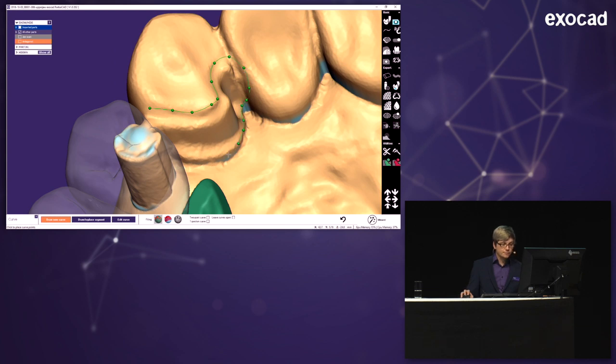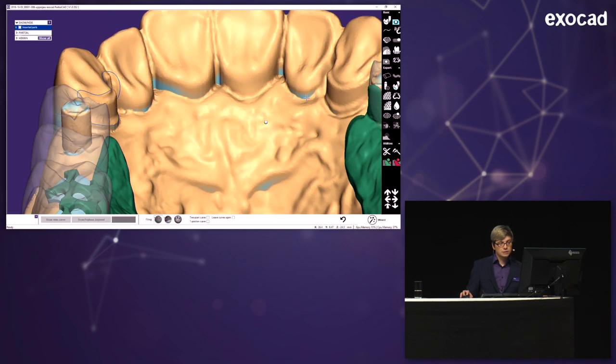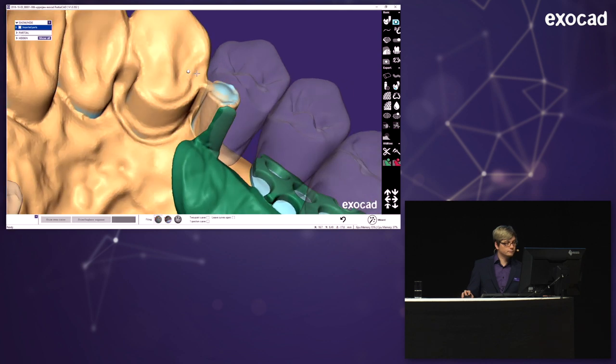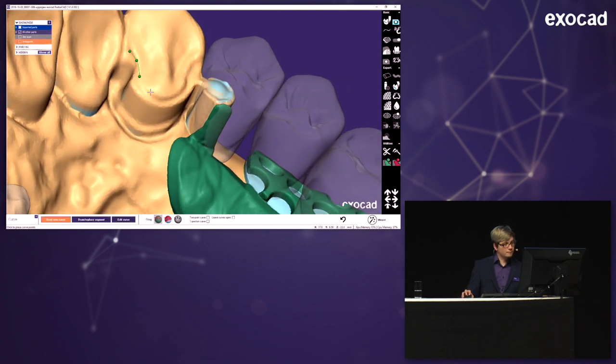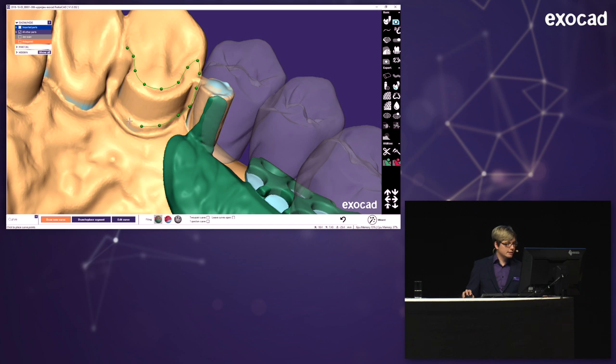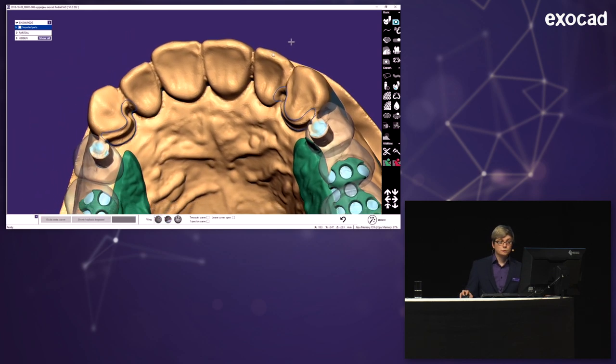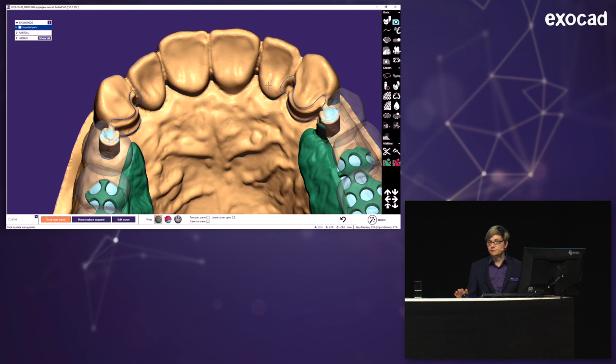You could also just use the clone tool to draw wax over it, but this is a bit of personal preference. I like designing it this way. And first, I'm drawing both of those curves. So just like that. And now I can actually choose any option what to do with those curves. I could potentially fill retention beads there. I'm not going to do that because it makes no sense.